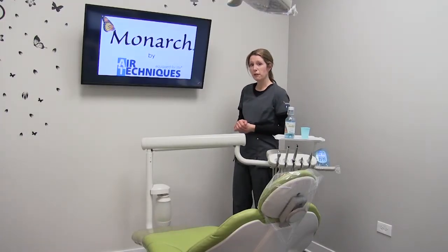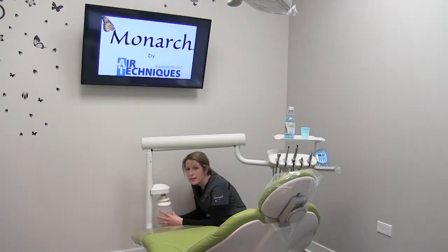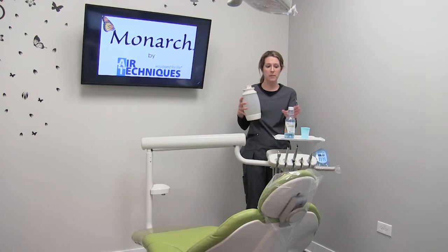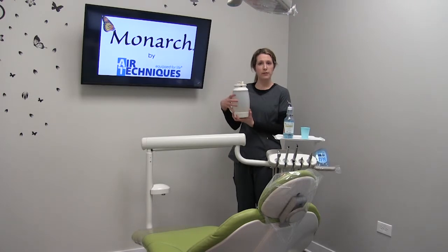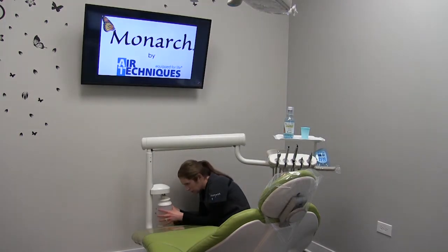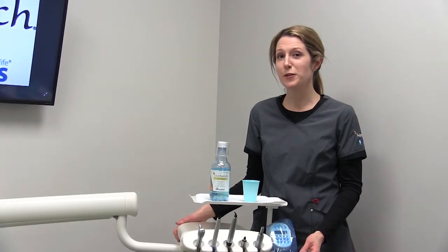The next day when you come into the office, you'll go ahead and take your bottle off the unit again. You'll want to empty out the remaining solution in the bottle. Once you have emptied out the Monarch Water Lines treatment, you'll go ahead and fill your water just like you normally would. Put it back on the unit and you're ready to see your first patient.